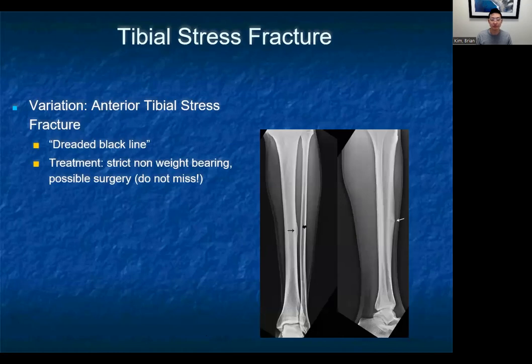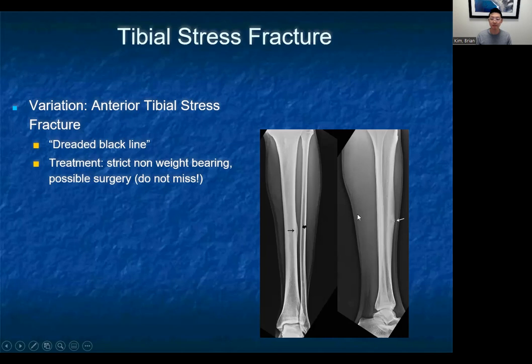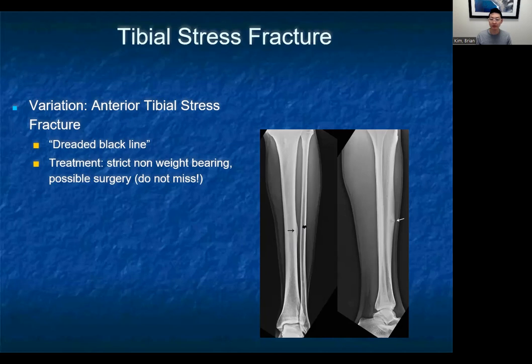This is an important variation you certainly don't want to miss — the anterior tibial stress fracture. People call it the dreaded black line because that's what you see on the lateral radiograph of the tibia, and that's what we have here on the right-sided picture. On this lateral view of the tibial shaft, there's a thin black line arising from the anterior tibial cortex. If you just had the AP view, you wouldn't necessarily know it was affecting the anterior cortex — another reason why multiple views are important. These are critical not to miss because treatment is different: with regular tibial stress fractures you can permit some weight bearing, but for anterior cortex fractures you want completely non-weight bearing, and some will go to surgery because of decreased healing potential.